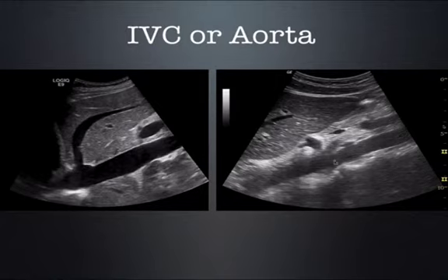Well, I just showed you this picture and told you it was the aorta, but hopefully you're paying attention and see this is a celiac trunk and this is the SMA. In this case, you can see the IVC is entering into the right atrium, and we can see that hepatic vein coming down to form the hepatic confluence before it dumps into the IVC. Okay, so that's the IVC, and this is the aorta.